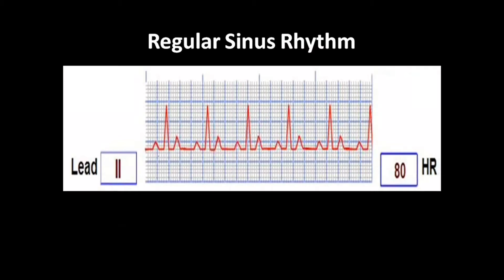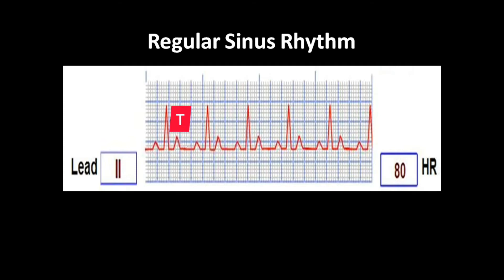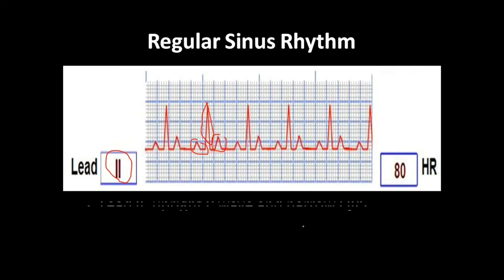For regular sinus rhythm, you can see the different waves like a P wave, a QRS complex, and a T wave. There will be an isoelectric line, and again there will be a P wave, QRS complex, and a T wave. This pattern will be repeating in a regular rhythm. This is what we can see in lead 2, and the heart rate will be at around 80 beats per minute.